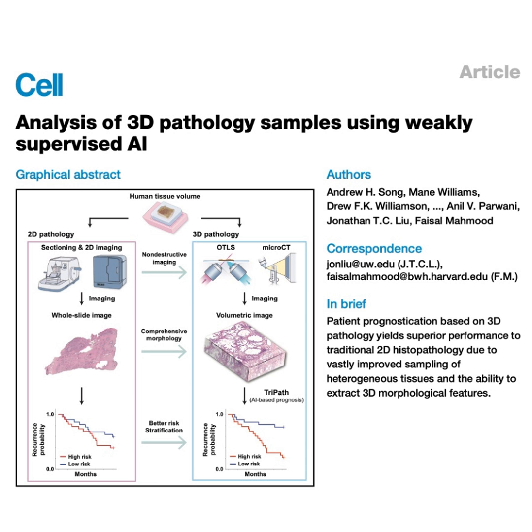A human pathologist just can't sit there and scroll through billions of voxels. It's completely impractical, time-consuming, probably error-prone, too. Right. The challenge flips entirely. It goes from trying to infer 3D from limited 2D to being overwhelmed by the complete 3D picture. Exactly. And that's where the AI TriPath comes in.